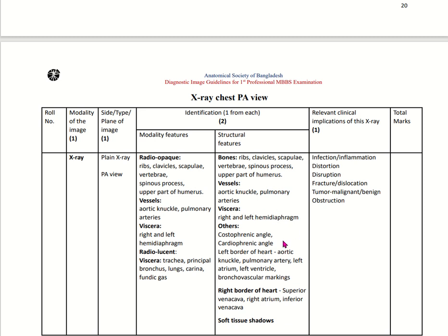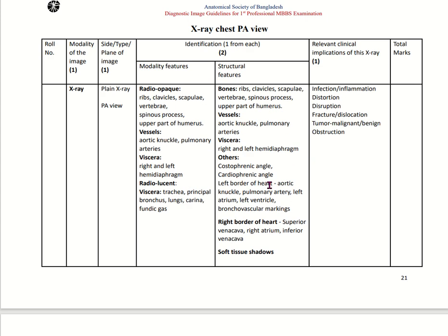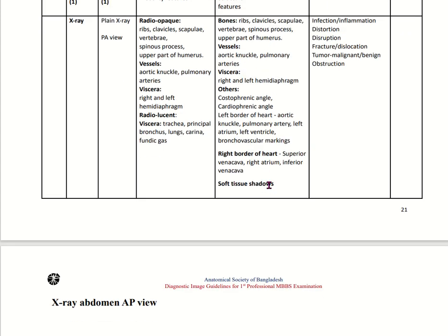You can also describe infection, inflammation, distortion, disruption, any bony fractures, any tumor, any obstruction. So this is the total answer of a diagnostic image.